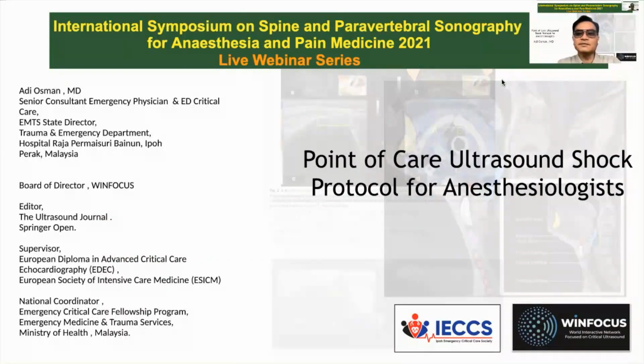First and foremost, I would like to thank Professor Manoj Karmakar and his team for inviting me for this live webinar series, whereby I'm going to discuss the point of care ultrasound shock protocol for anesthesiology.